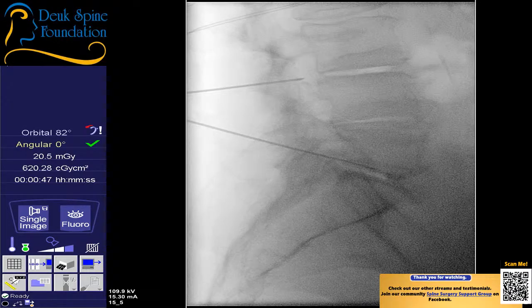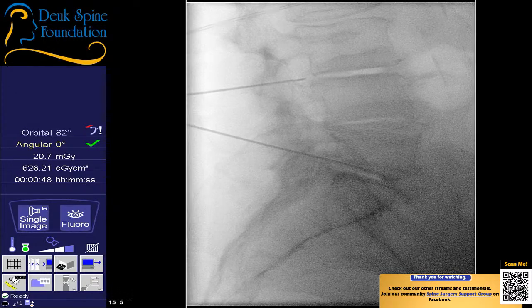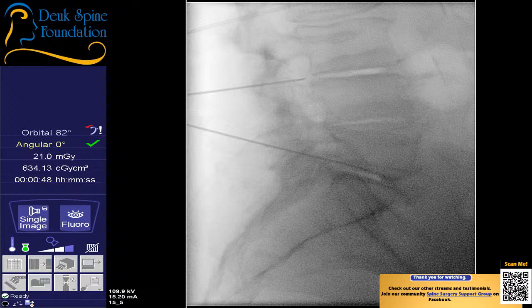Let's see. Are you okay? Do you feel any discomfort? Where is it? Not down her leg. All I want to know is if it goes down her leg. Not down the leg, right? No, not down the leg. Definitely at the back of the disc.